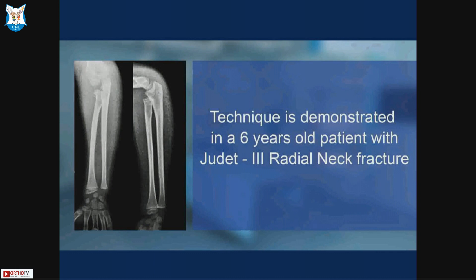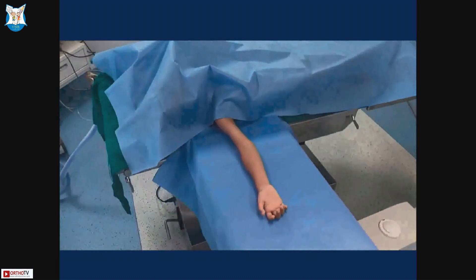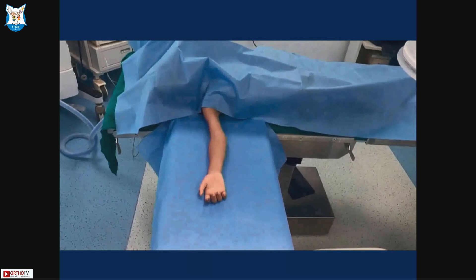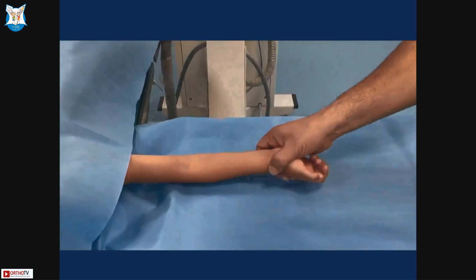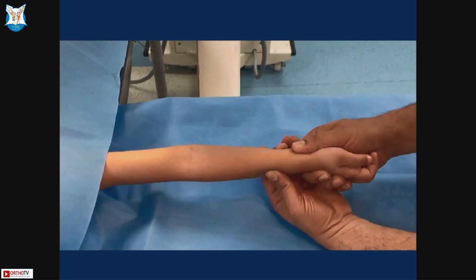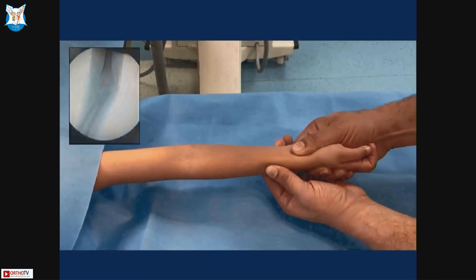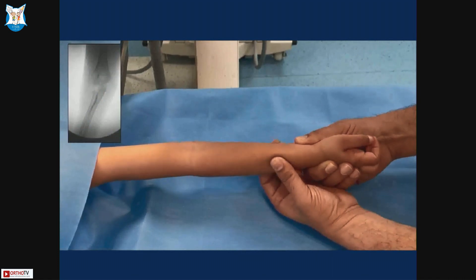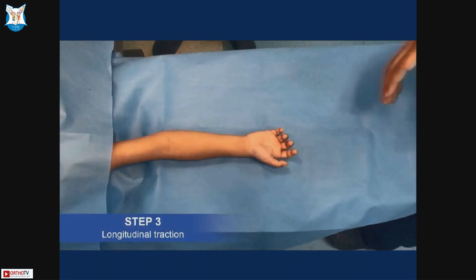I will show you this in a six-year-old patient — this video has been published in JBJS Essential Surgical Techniques. The child should be placed on a radiolucent table at the edge, with the image intensifier coming from the leg side. Step 1 is to view the radial head in profile — move the forearm in pronation or supination, most often slightly more than full pronation, until you see a rectangular radial head, which is the pre-injury position.